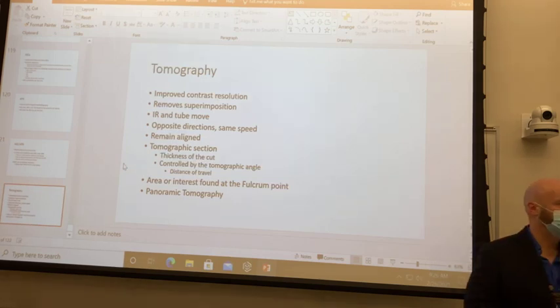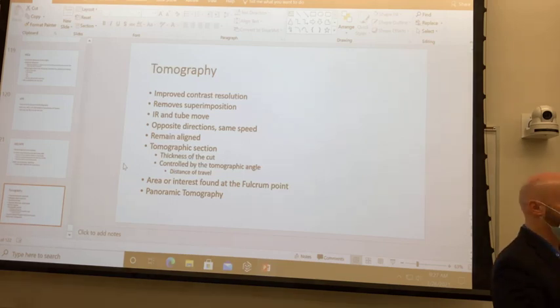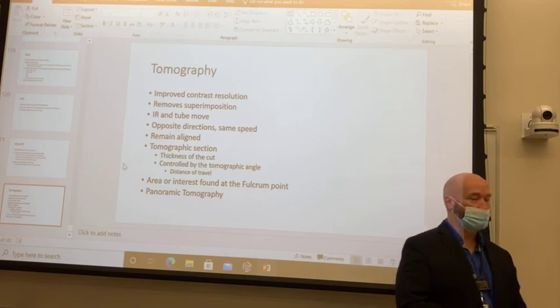And going back to chapters 5 through 8, is thermionic emission the same as space charge? Yeah, thermionic emission and space charge are the same. That's just the heating of the filament until you get those electrons ready to send.